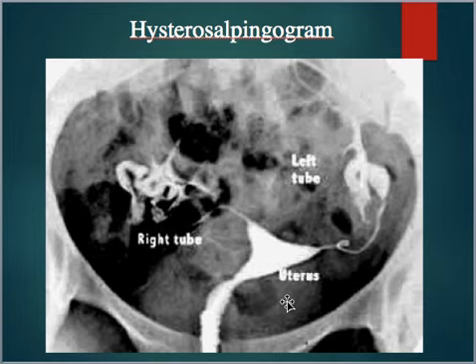These procedures can be done for a couple different reasons. If a woman has been trying to have a baby and is unsuccessful, this is one of the steps to make sure there's not a blockage or something going on. They can tell even if one fallopian tube's open, then there's still a chance of them being able to have a baby. The other reason that we do them is for sterilization procedures. So if the tubes have been tied or other procedures that they do to block them off, we'll put the contrast in to make sure that it's not flowing to the fallopian tubes, to make sure that the sterilization worked.